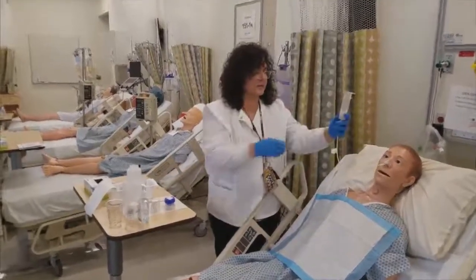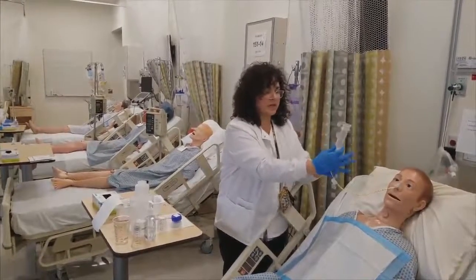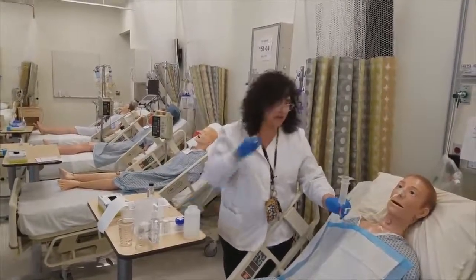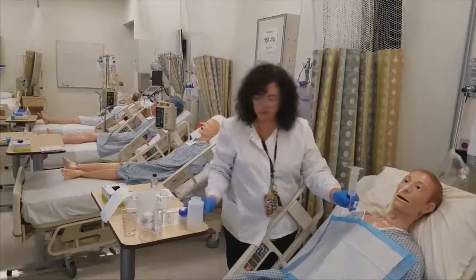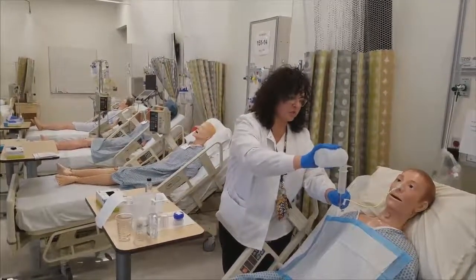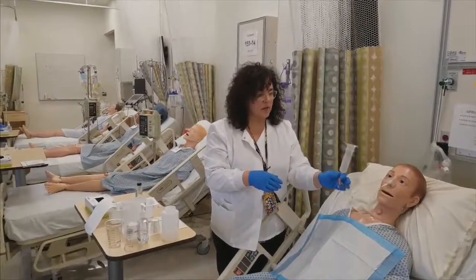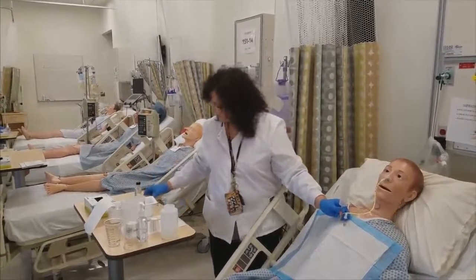and then let it drain by gravity. When it gets to the tip, I'm going to drop and pinch it, and then I'm going to give an in-between flush of 15 to 30 milliliters. So just use your nursing judgment as to what end of the range you want to be at. So let that go, and then I'm going to go ahead and give my lactulose now.